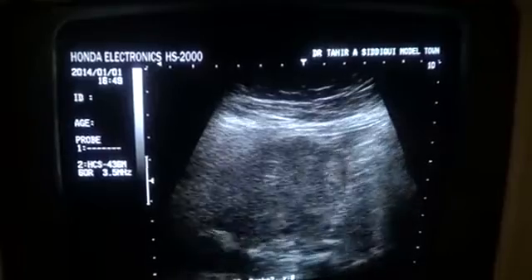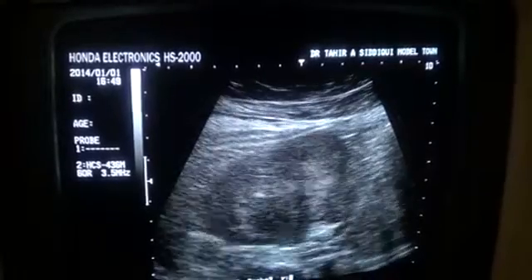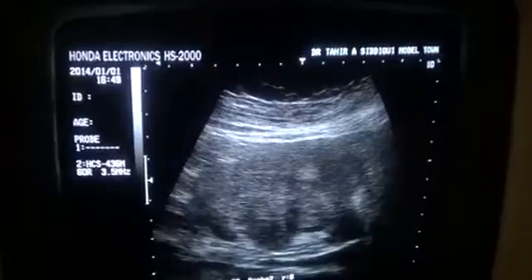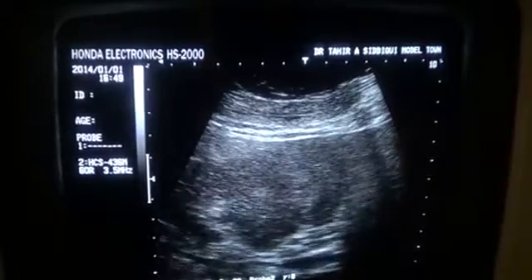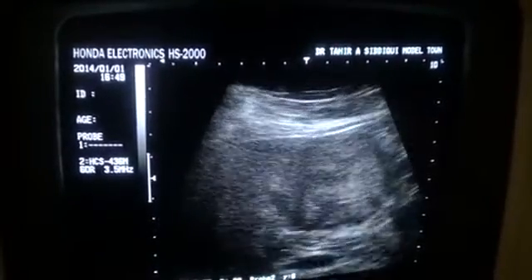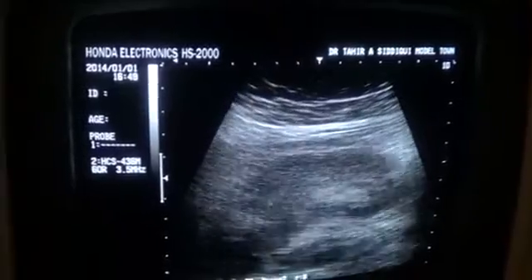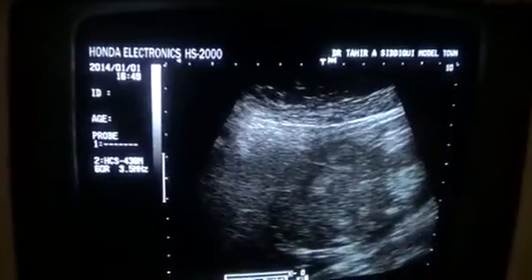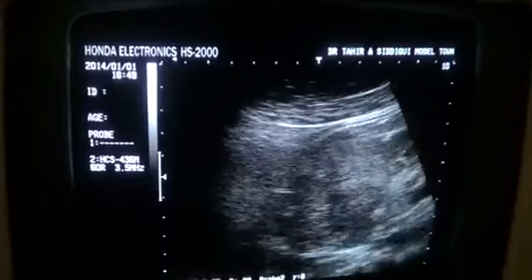Now I am going to give a sweep to the probe, keeping the mass in view. This is a 180-degree sweep given to the mass, coming back to the normal position. You can see the movement of the mass with the kidney — it is distorting the region, and from here onwards we do not see the capsule of the kidney; rather we see the mass elevating it, and the perirenal fat is not seen in this region.